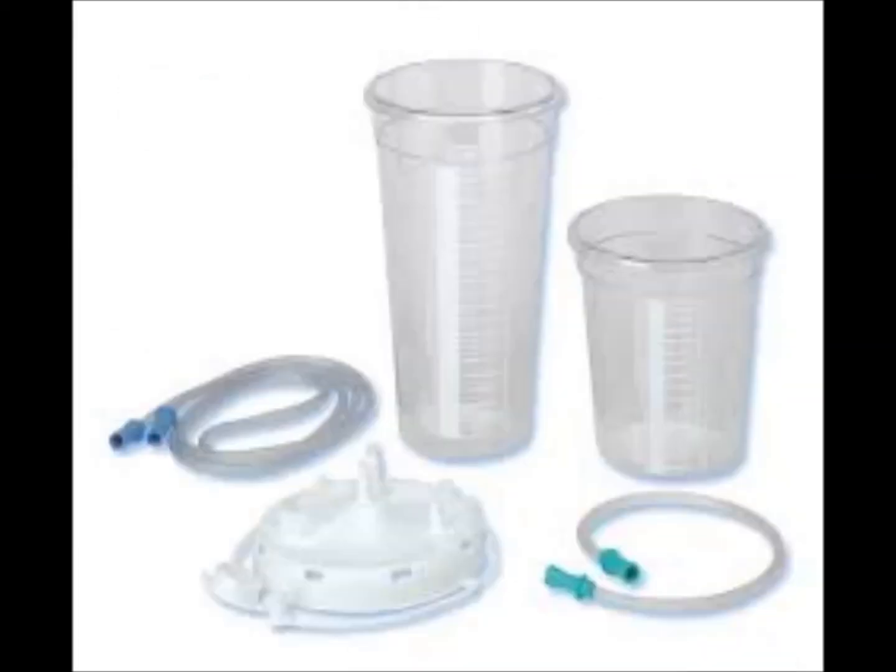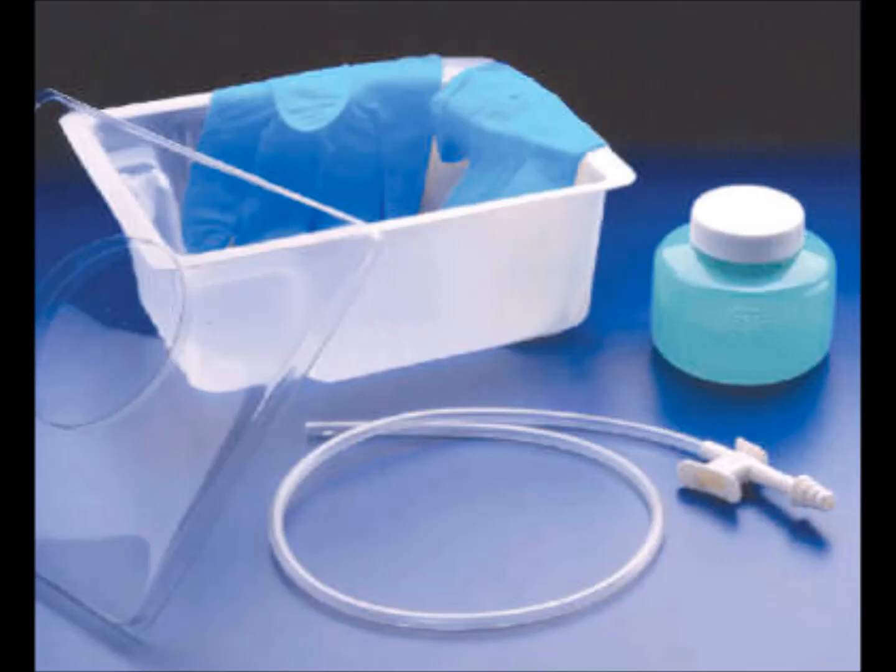Second most important item to have in a patient's room is suction. This is a wall suction picture, which is necessary to clear a patient's airway whether you're suctioning the oral or tracheal airway. The other part of the suction required is tracheal suction kit, which comes in different sizes and is best to keep about 5 kits at the bedside. Typically 10 French and 8 French are sufficient, but this always depends on what size of the trach the patient has.